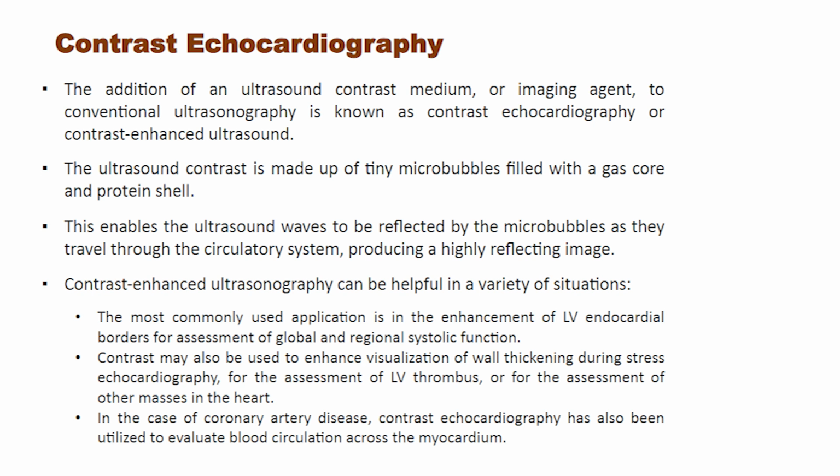Contrast may also be used to enhance visualization of wall thickening during stress echocardiography, for the assessment of left ventricle thrombus, or for the assessment of other masses in the heart. In the case of coronary artery disease, contrast echocardiography has also been utilized to evaluate blood circulation across the myocardium.